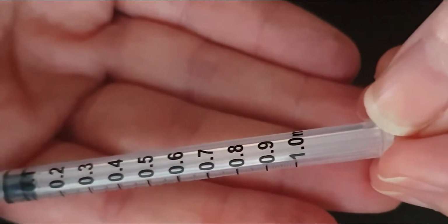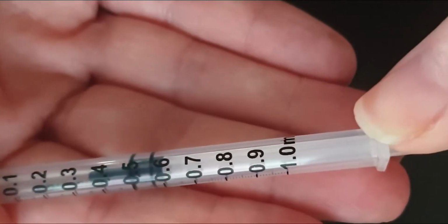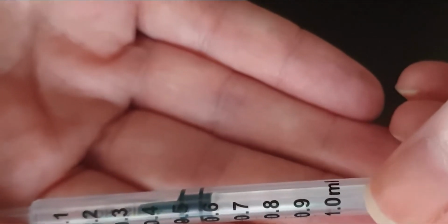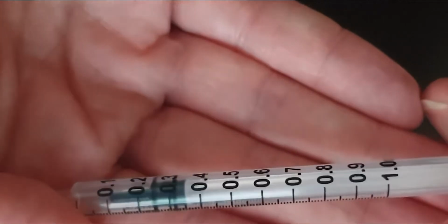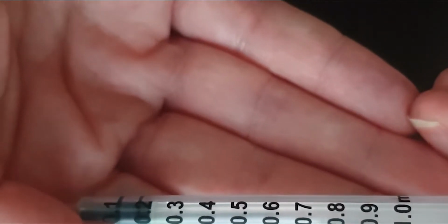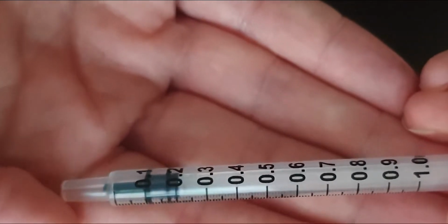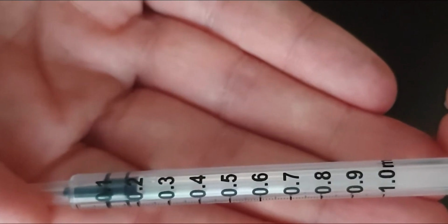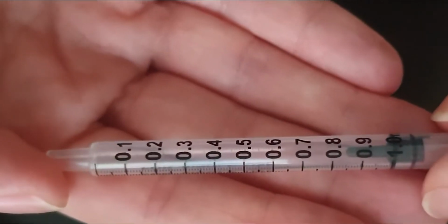So if you're giving 0.5, that's about 50 cents. So 0.5 of a mil will be to the 0.5 mark on the syringe, 50 cents. 0.1 is like 10 cents. So $0 and 10 cents. You can see there, 0.1. It's very important not to get 0.1, which is 10 cents, and 1 mil, which is a whole dollar, confused.